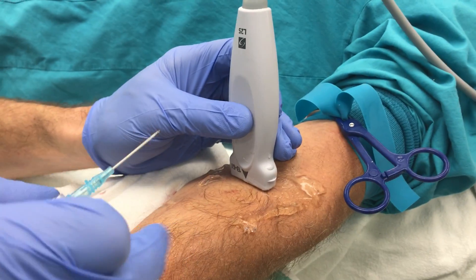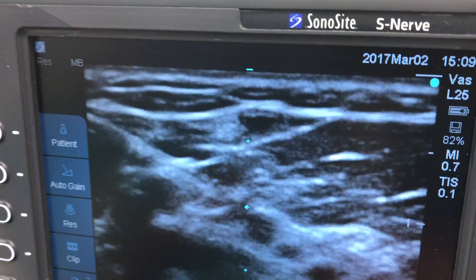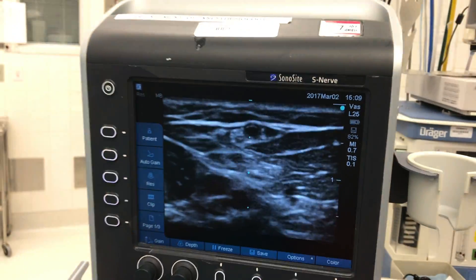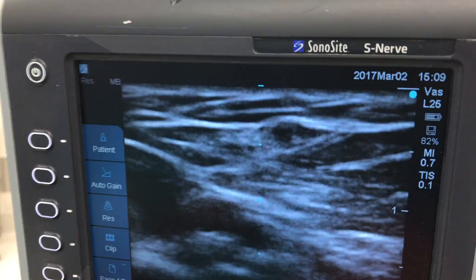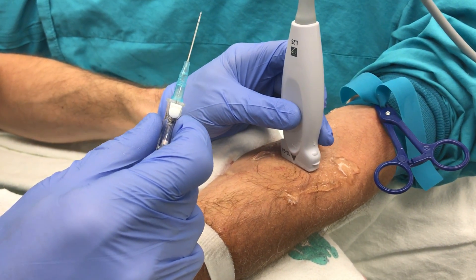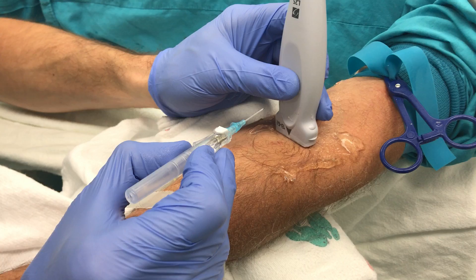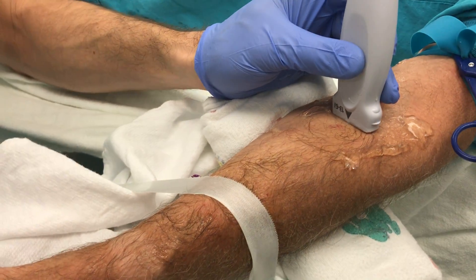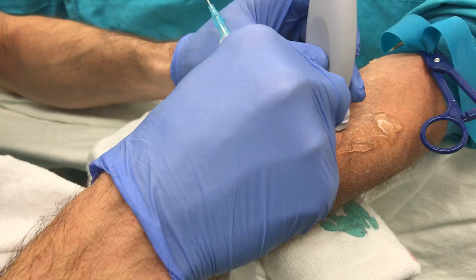I'm sitting so that my needle, the probe, and the ultrasound machine are all in line with each other, and you can see I've got a vessel right in the centre of the screen there. I'm just going to ensure I know which side of the probe is which. The key to this technique is following the tip of the needle into the vessel.